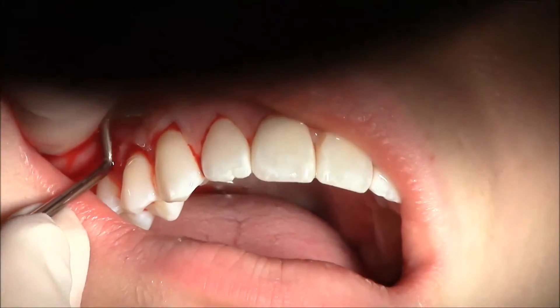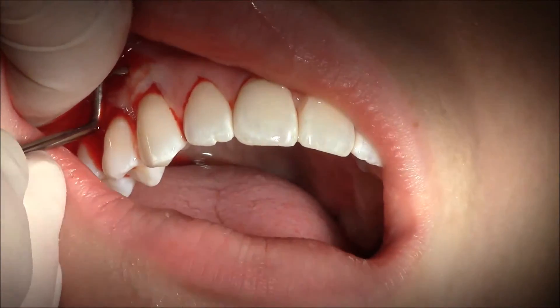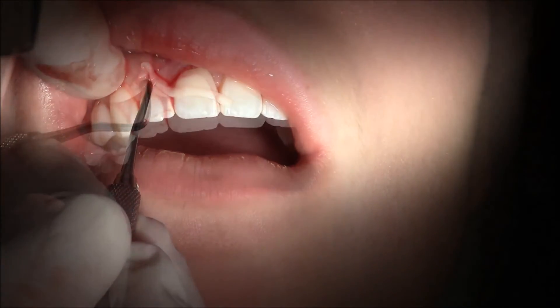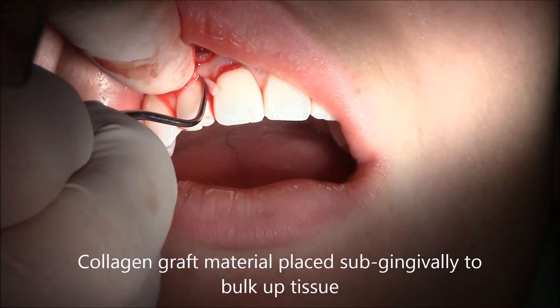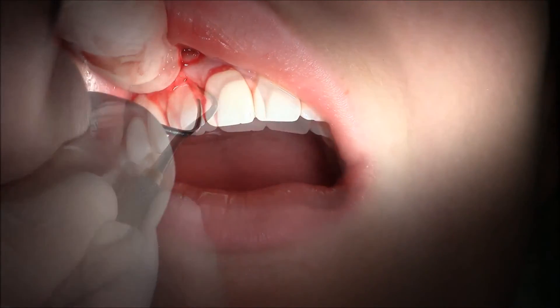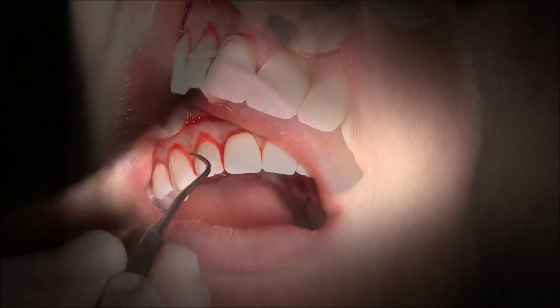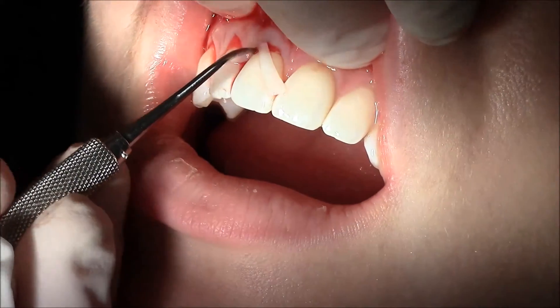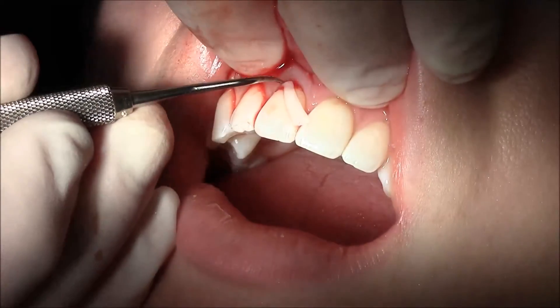Once we get it teased down and moving gently, we start packing in collagen material. This collagen can come from three different sources: there's porcine collagen which comes from pigs, bovine which comes from cattle, and ovine which comes from sheep. This sterile material is carefully packed up underneath the sulcus and it plumps back out the tissue, making it thick like it used to be. We often see this post-orthodontic, where the arch has been expanded to get rid of crowding and the roots are out a little far on the bony structure, so the gum tissue tends to recede.